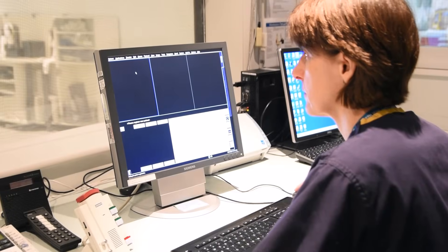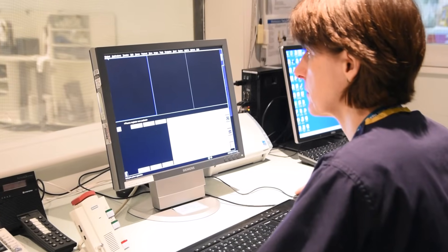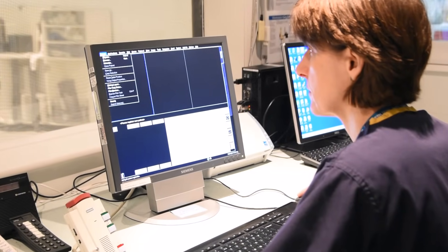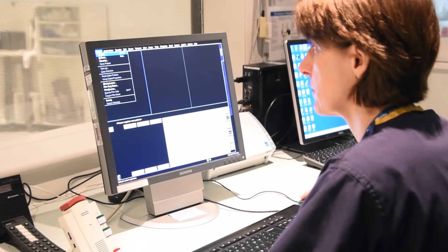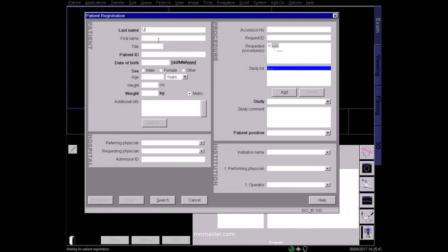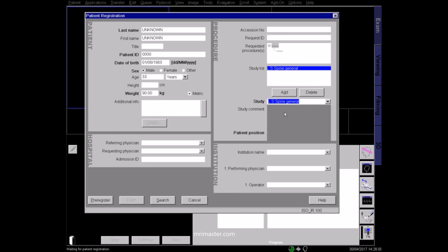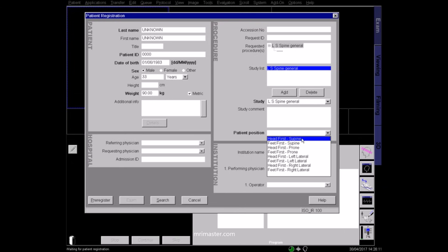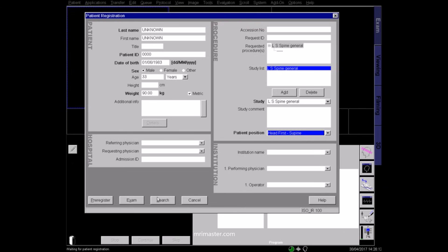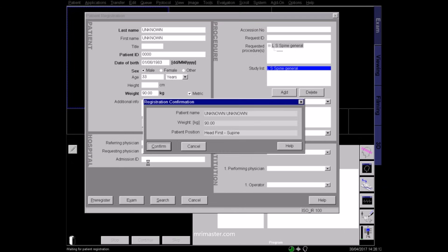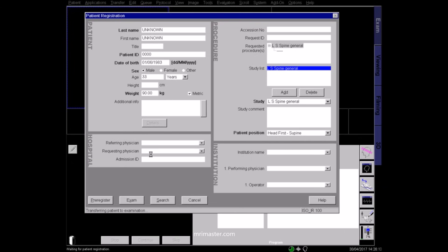Once back in the control room, select the patient details in the browser or type them in manually. Accurately enter all patient data, including the patient weight, so that the specific absorption rate can be calculated correctly. Register the patient as lying head first and supine.